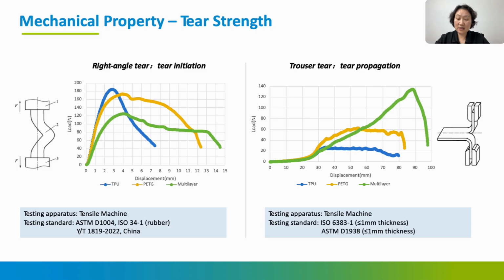Aligners and retainers should be durable during the designed lifetime. But durability is a complex term. Any defects or failure, such as crack, breakage, warpage, permanent deformation, can lead to the need for new aligners. Aligner breakage is one of the most common failure types complained about by patients.